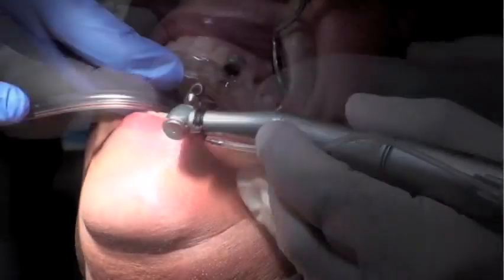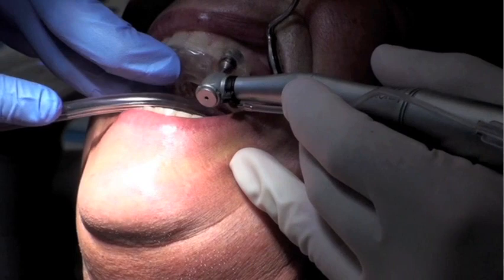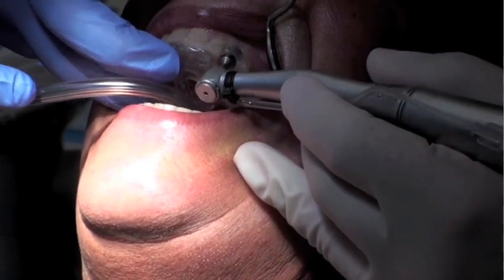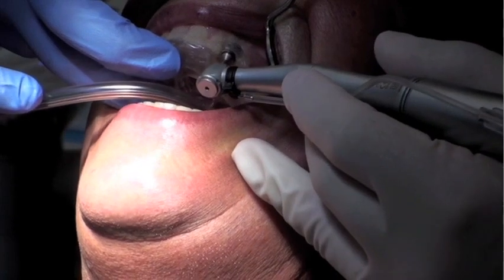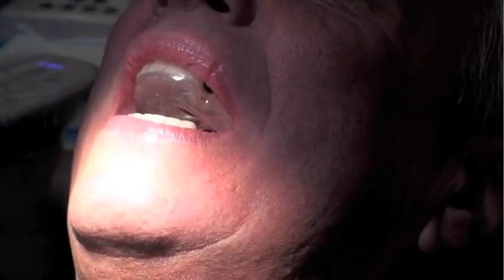This patient has already been anesthetized. What we're doing at this point is a guided soft tissue punch. In this case, this tissue punch comes with the Astra Facilitate kit. We're using an irrigated handpiece with sterile saline solution as irrigation.